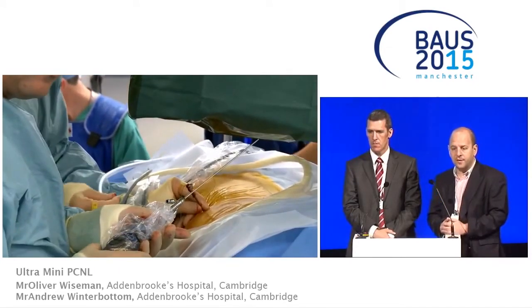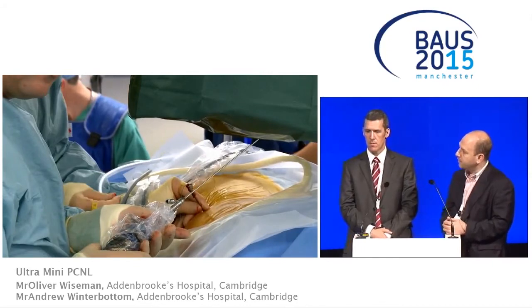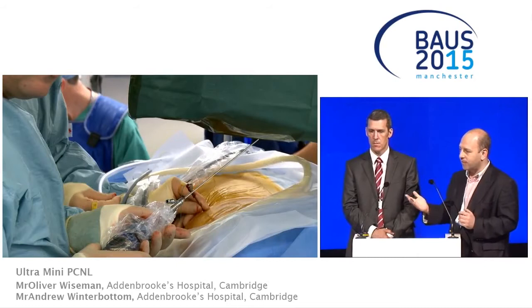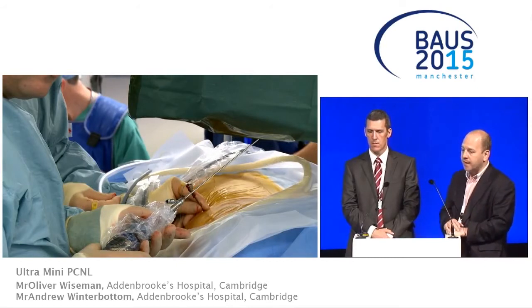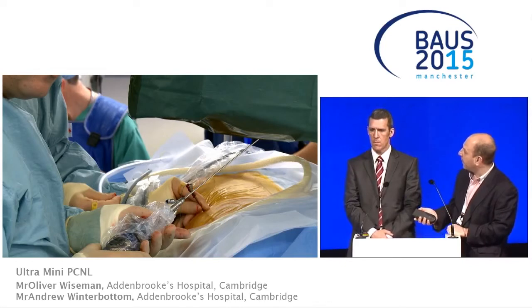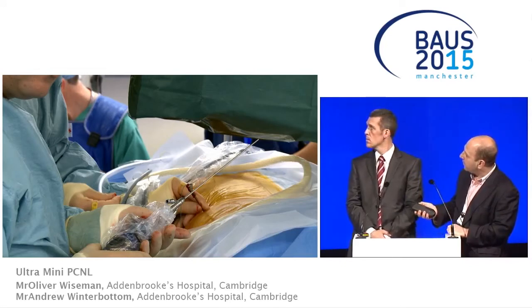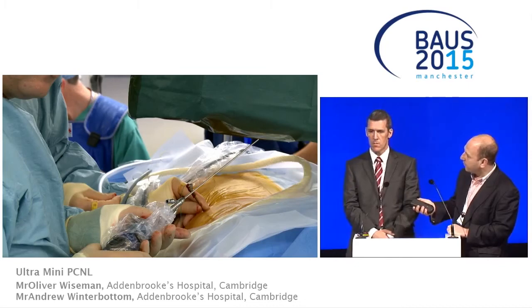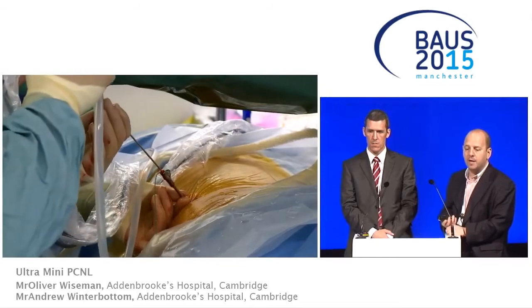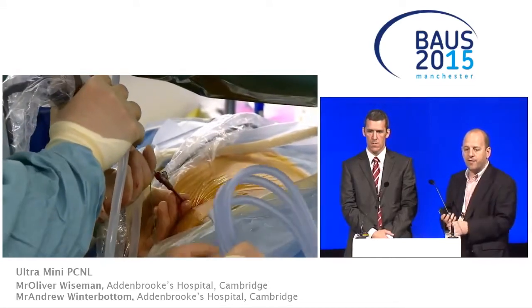Now it's kind of a scary moment, because normally I like to have a wire on the outside, as we talked about for the other PCNLs, and a wire on the inside as well. But you'll see with this kit, in fact, this is the kit here, the outer obturator. There's a flushing port on the side, and that connects to a little tube which runs down the middle of the kit and allows you to flush fragments out.